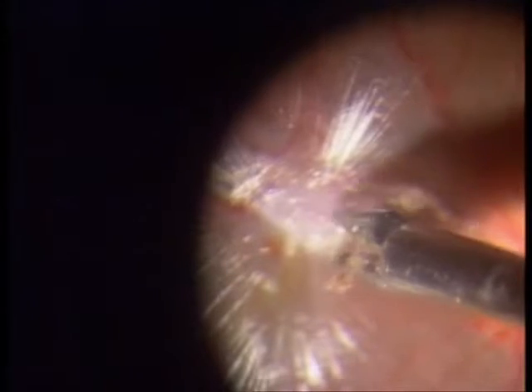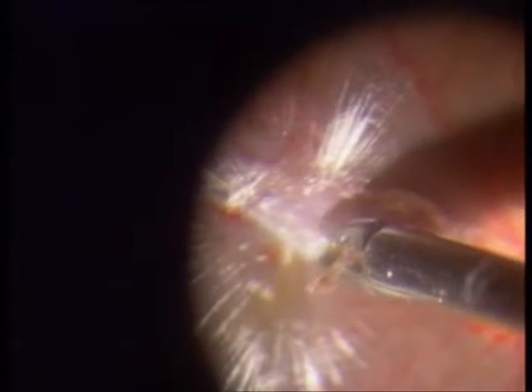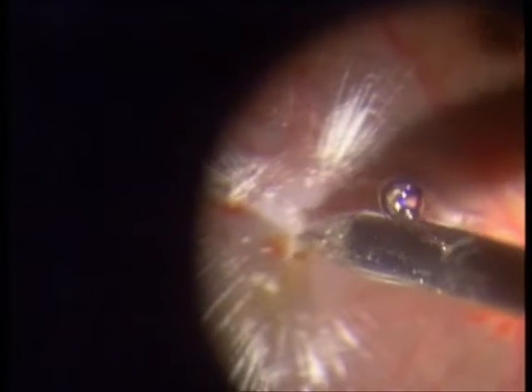Once we have a firm edge, we grasp it with a forceps and again peel it off in a tangential fashion. With the triamcinolone, the visibility of the membrane is much better. You can see these fine petechial hemorrhages created over the retina as we remove the membrane.